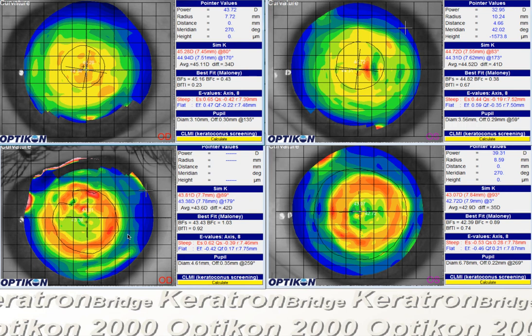The lens does look a little bit loose in the periphery, and it's possible that tightening the lens could make the topography look a little bit better. I really don't know how much clinical improvement that would provide to the patient, but that's one possibility. I also think some of this is probably artifact.